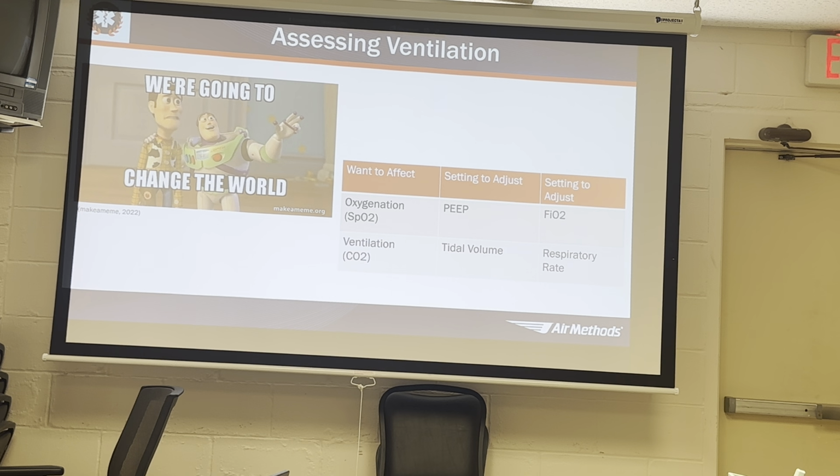So maybe your patient's just intubated, been on the vent for maybe 15, 20 minutes, and they're still satting like 88, 89, I hope not. What are some things that as a nurse we could go to the provider and say? Hey, I think we should get the PEEP up on this patient. I think we should turn up the FiO2, and then work with the provider and your respiratory therapist to make those things happen. Ventilation, as far as CO2, is making sure that we're giving appropriate tidal volumes.